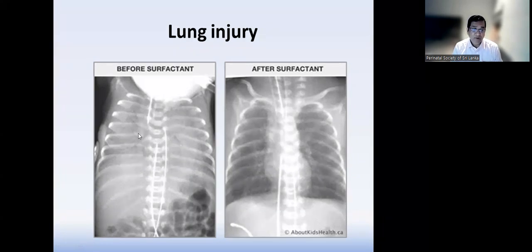If you ventilate this baby without giving surfactant, you will still aerate the lungs with high pressure, and there is a lot of atelectasis at the end of expiration, which will cause a lot of damage. You will have to use a lot of pressure to open this lung, so there's pressure damage and atelectatic trauma. When you look at this one, it is now well expanded. If you are not looking at your volumes, and this is where volume comes into clinical practice, you may be happy. You may have nice oxygenation and acceptable carbon dioxide level, and everything seems fine. But if you look at the lungs, they're overexpanded, and we may be delivering unnecessary volume of air through the endotracheal tube, which is causing volume trauma.